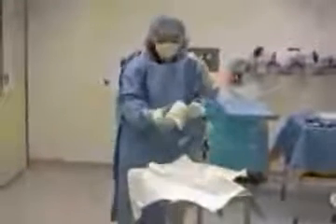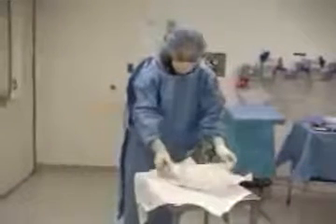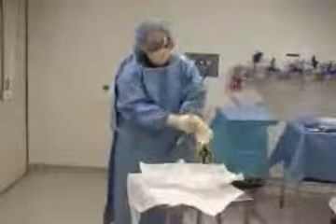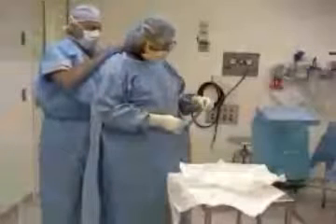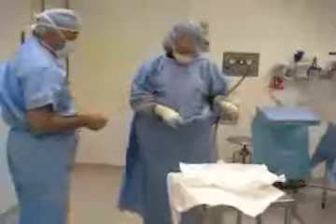Once you have this pair of gloves on, it doesn't matter whether the second pair is upside down or right side up — you just put them on and be careful that you don't contaminate yourself. Notice that when I'm putting on these gloves, I'm not playing around with the papers. Once you're done with this field, you leave it. At some point, someone will tie in the neck part of your gown. When that's done, with your left hand, you grab hold of the tag that's on the side of the gown.